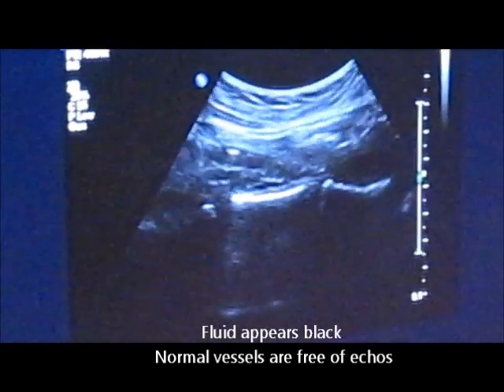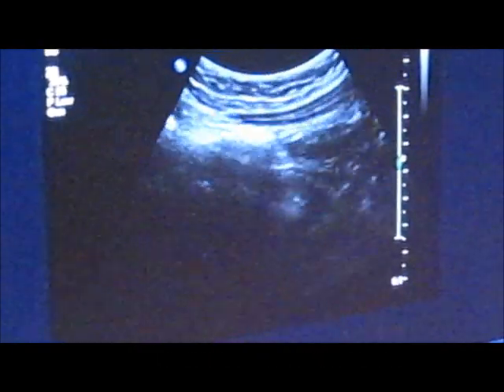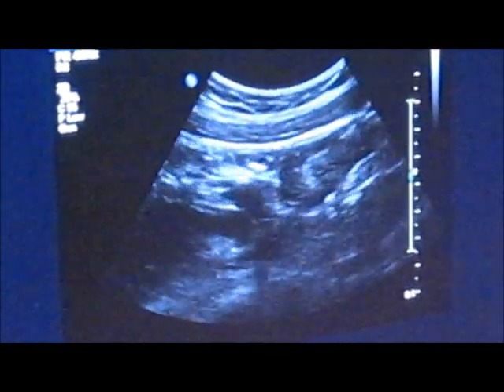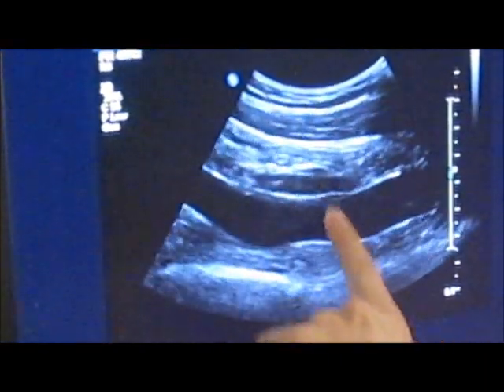You can follow the aorta all the way down. Let me know if I'm pressing too hard on your belly. I don't want to hurt you. So this is part of your distal aorta. This will then bifurcate into your iliacs, right and left iliacs, right here. So you have one here and one here.